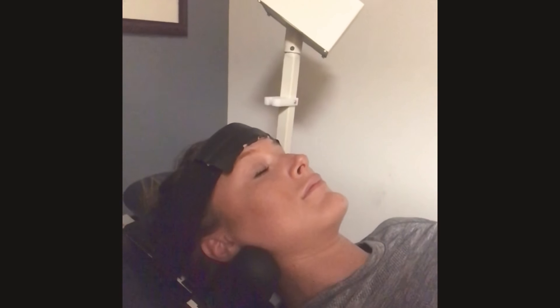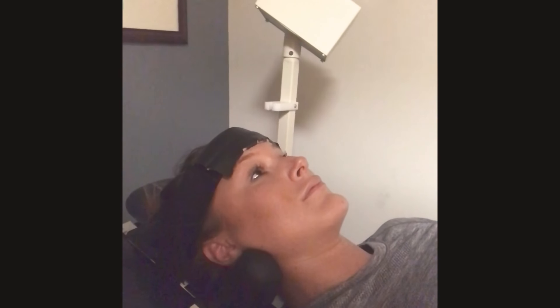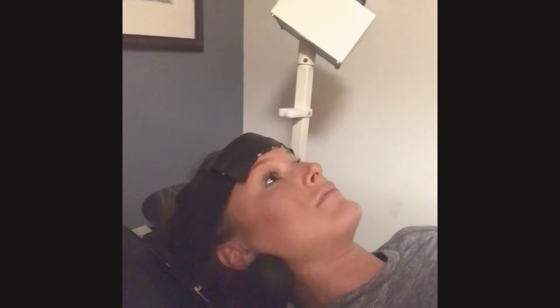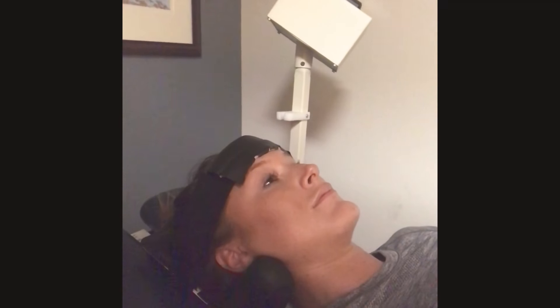And this is my favorite part of physical therapy. We do this for about 10 minutes at the end of my session, after I've completed all my other exercises. And I absolutely love it — I look forward to it.